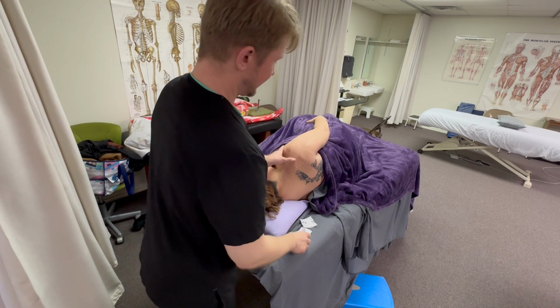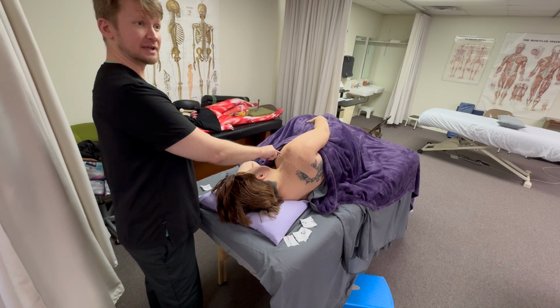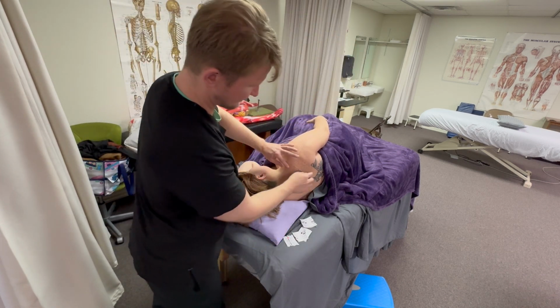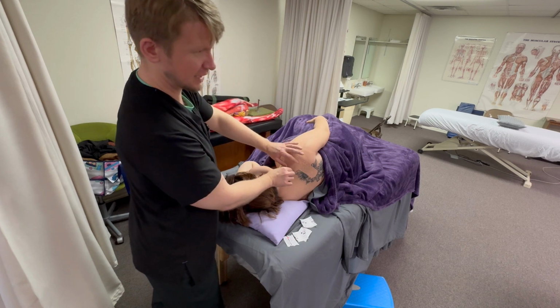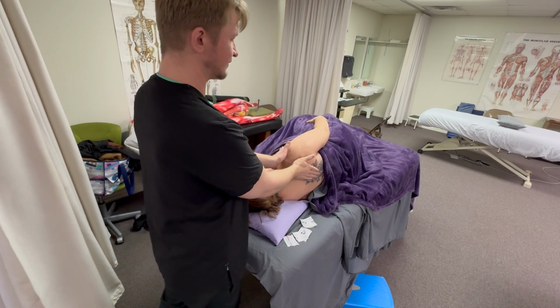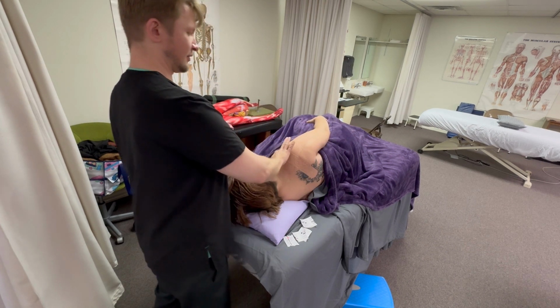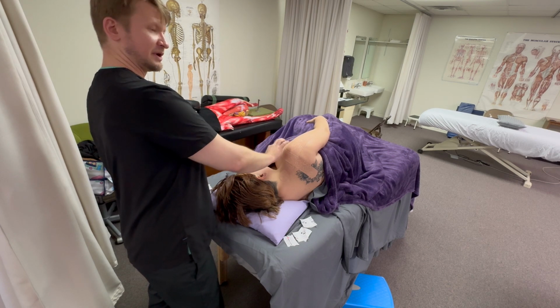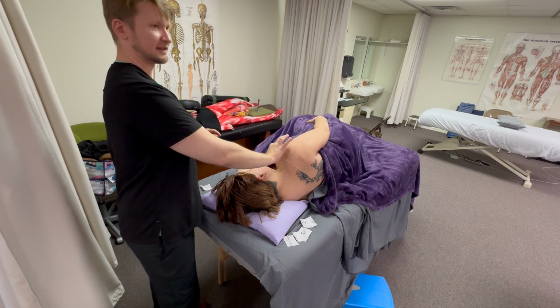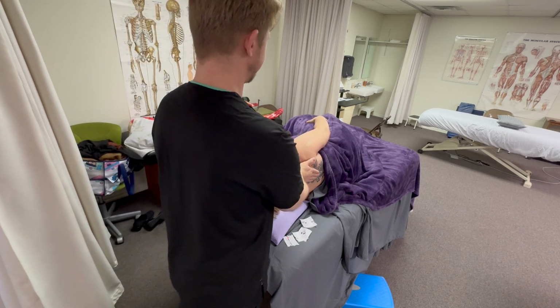Now, I do have this anchor sitting on top of a piece of tape. It's usually okay, but if that part is right on top of tape, it sometimes will roll up more easily. I would prefer all of it, at least the ends, to be touching skin. So this is okay, but if I had to, I could peel this back, trim that off, and set the anchor higher up. But I think it'll be okay for where it is right now.